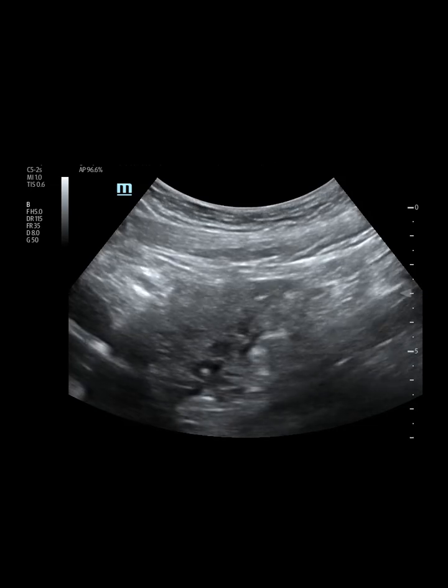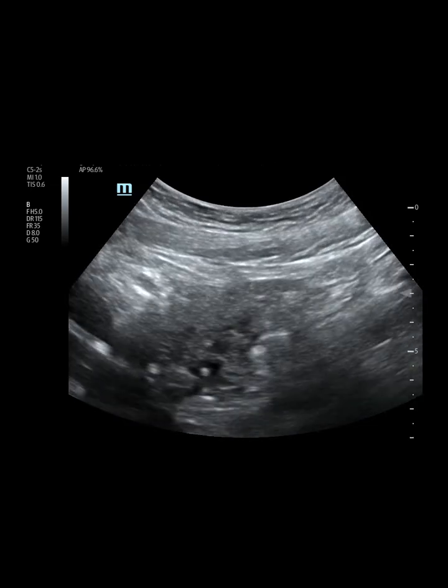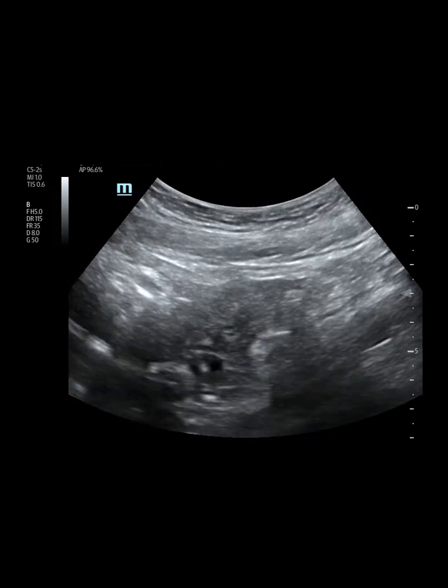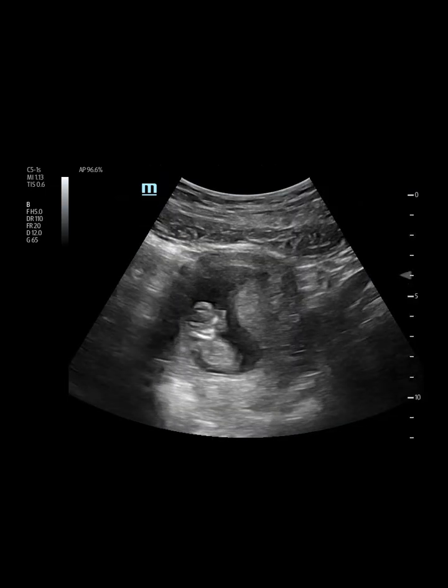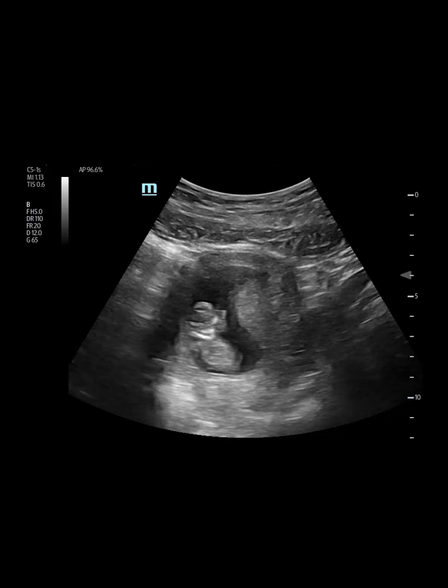Unfortunately, in our line of work, you may come across a fetal demise. Interpreting these types of results can be very complex and confusing. I will 100% of the time always send these patients for a radiology-based ultrasound. And in that same regard, if you're ever not confident in what you're seeing, don't hesitate to send that patient for a follow-up radiology ultrasound.